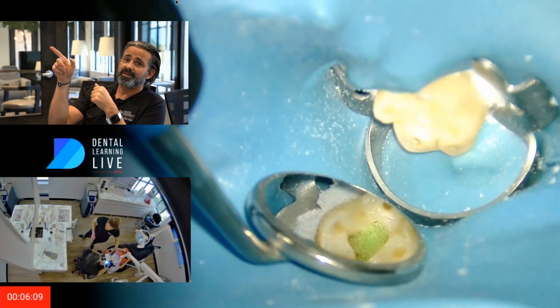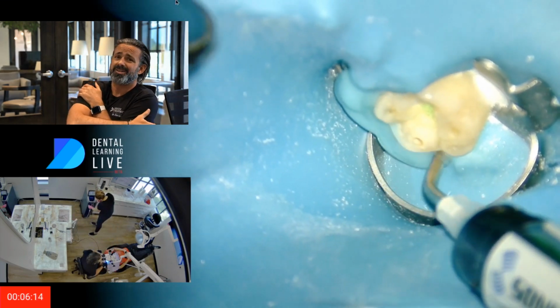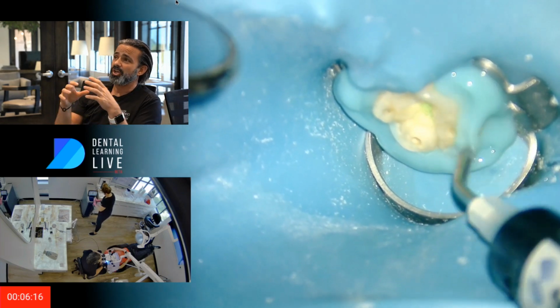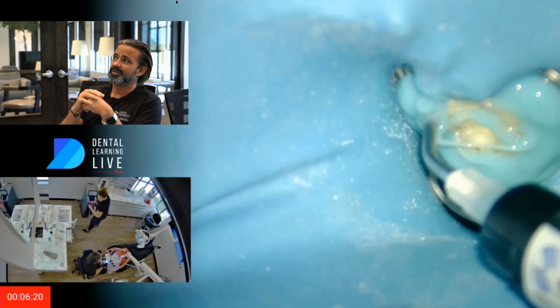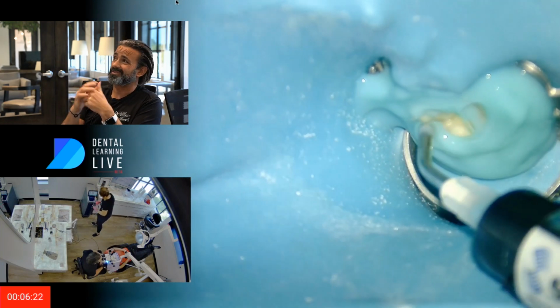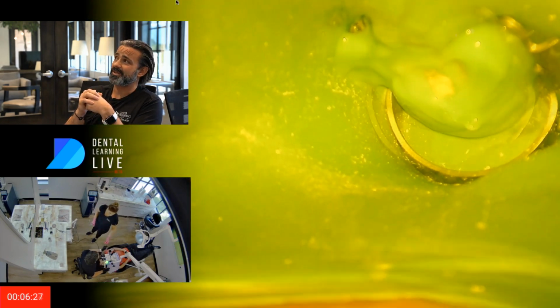What I did there is I took alcohol and went around it to dry everything up, and I went right to GentleWave. I actually knew the canals were so open. See, there you go, here's his movements. I used files significantly smaller in that. I was just creating a pathway for the fluid dynamics, and then coated everything around with that sound seal. And honestly, what's in my mind right now is platform, platform, platform.